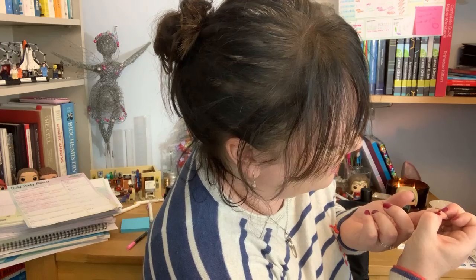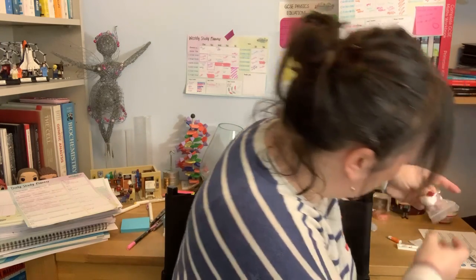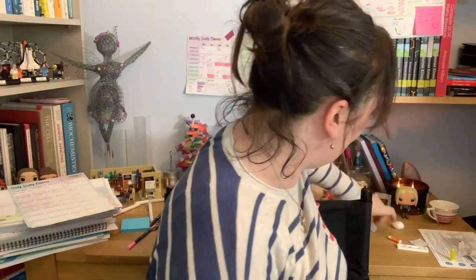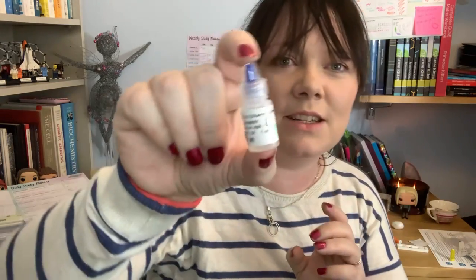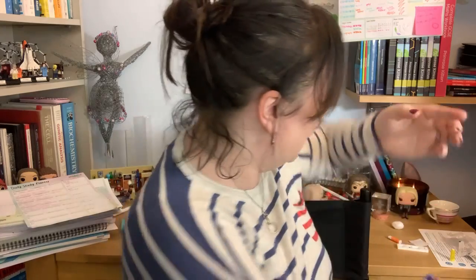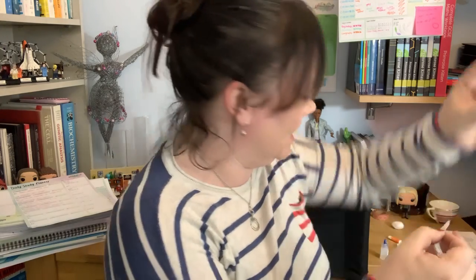More blood. More blood. Load blood. Blood in there. Then they've handily provided you the cotton wool. I'm really sorry, Sam. I definitely should have put some kind of warning on this. Blood, done. And then you get a little bottle of buffer. This is properly like being back in the lab while I'm still bleeding. They also provide you with a handy plaster to stop you bleeding all over everything. So let's put on the handy plaster before I bleed all over everything.